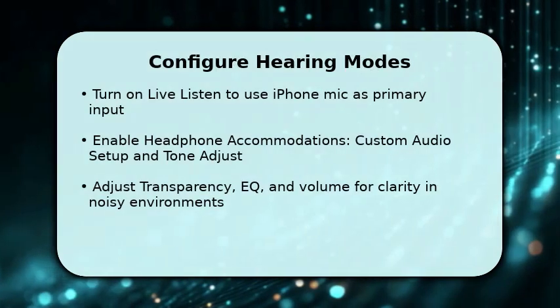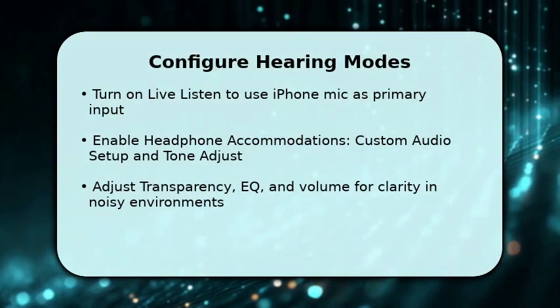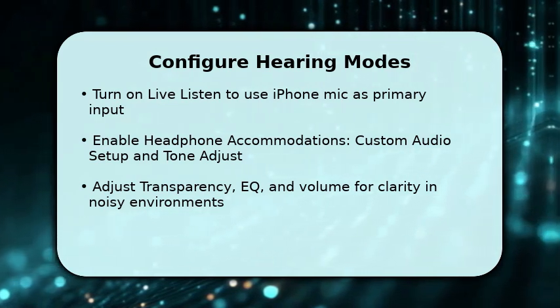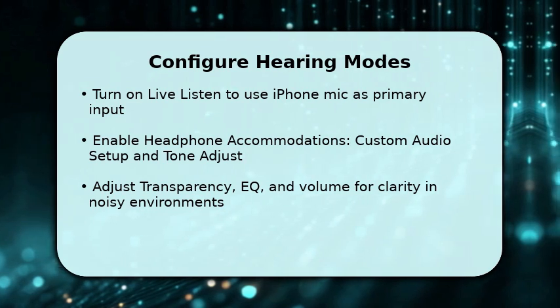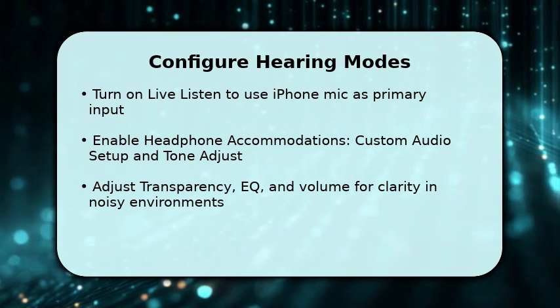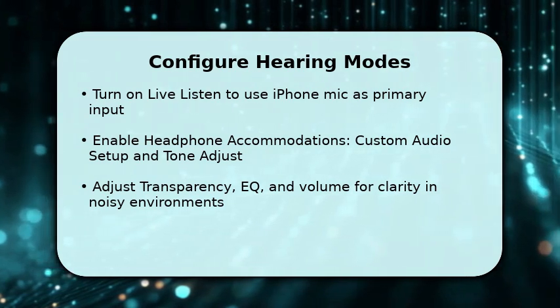You should now configure modes for clarity. Enable Live Listen so the iPhone mic streams directly to the AirPods. This reduces distance-related loss. Next, tap Headphone Accommodations and run Custom Audio Setup. It tailors frequency boost and balance to your ears.